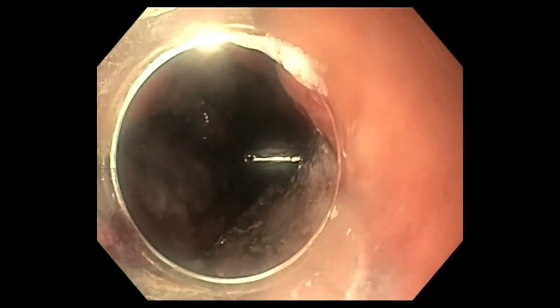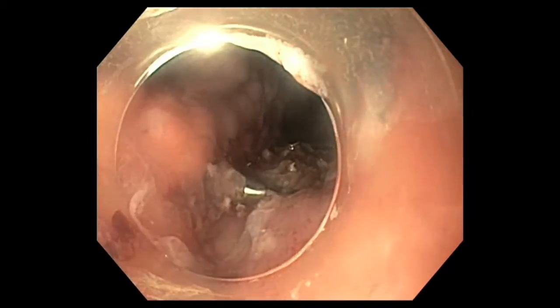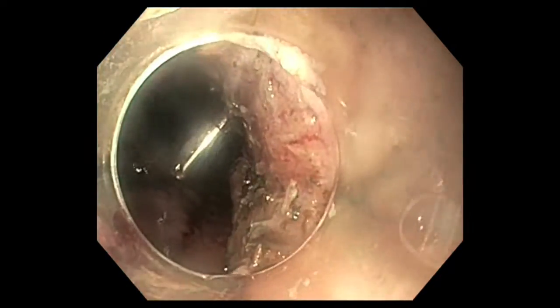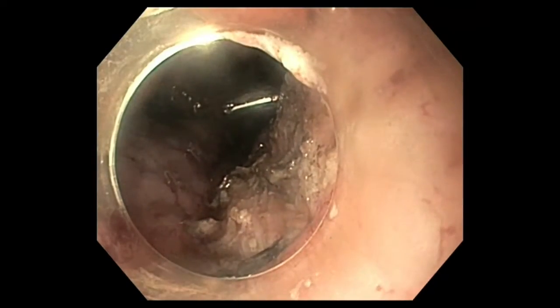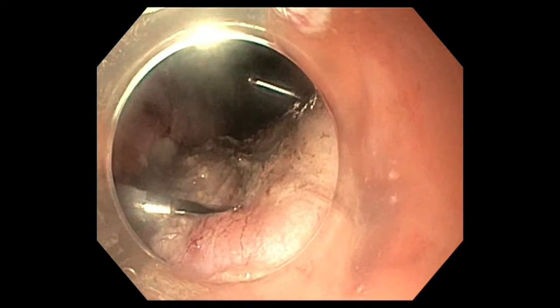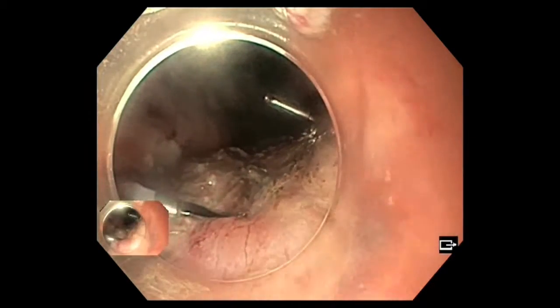This decision to close the artificial ulcer is not recommended by Japanese experts. However, in our case series of gastric ESDs, we have not yet experienced any case of late bleeding or perforation, even in patients with anti-aggregation treatment.